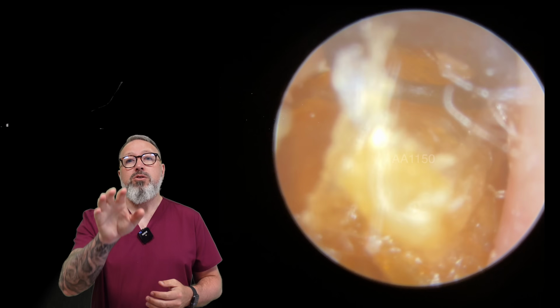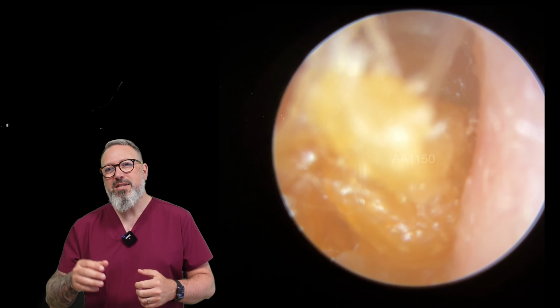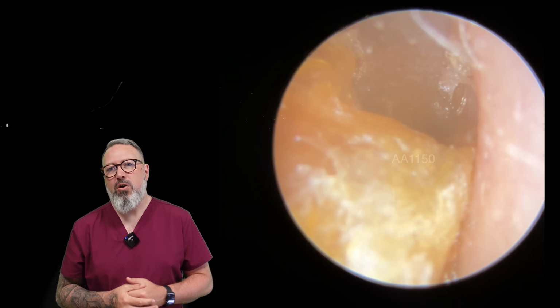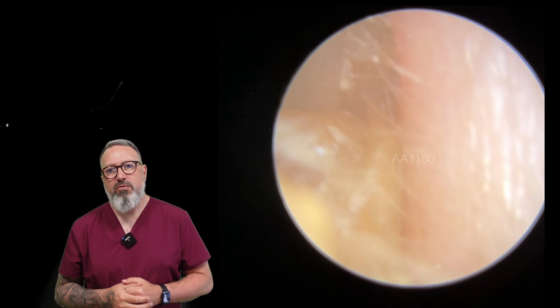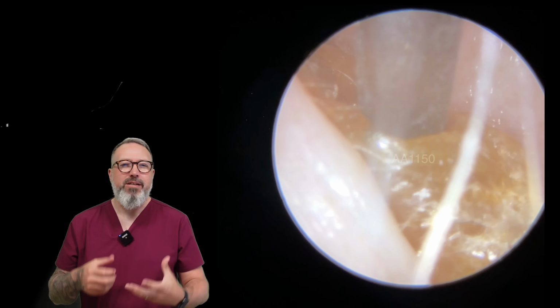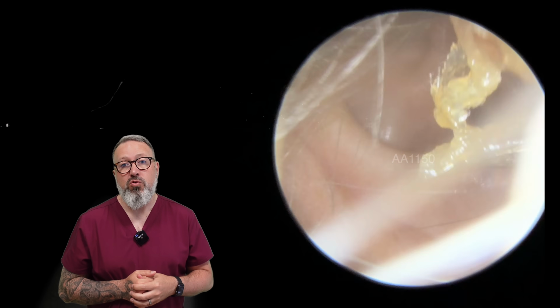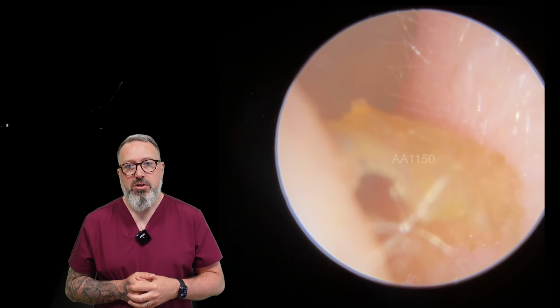So I've had to go in now with the curette here, just to go over the top of this, to break through that little bit of skin, just because the suction didn't carry enough power really to pull that skin out. So with this one now, we can just go over the top and draw this down, and you can see it looks a lot clearer there.